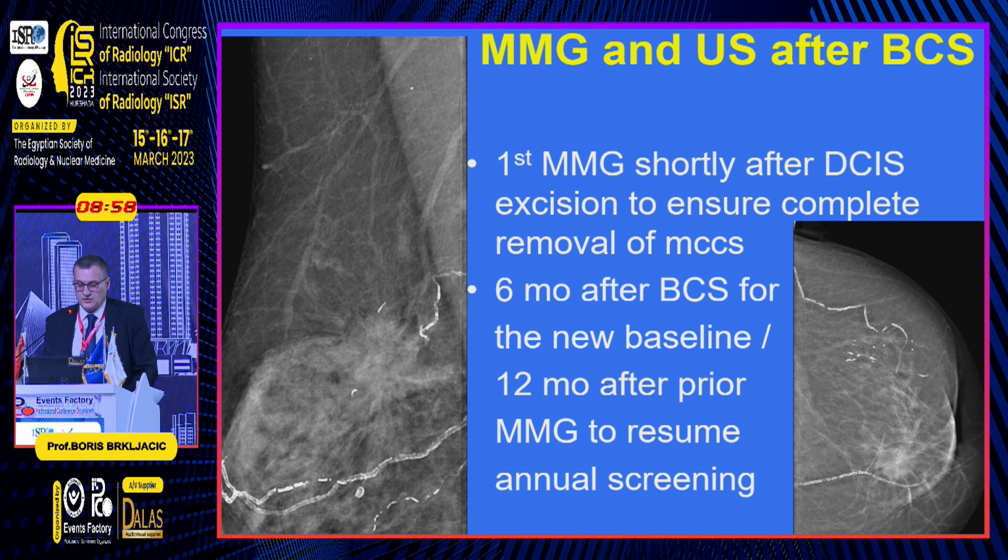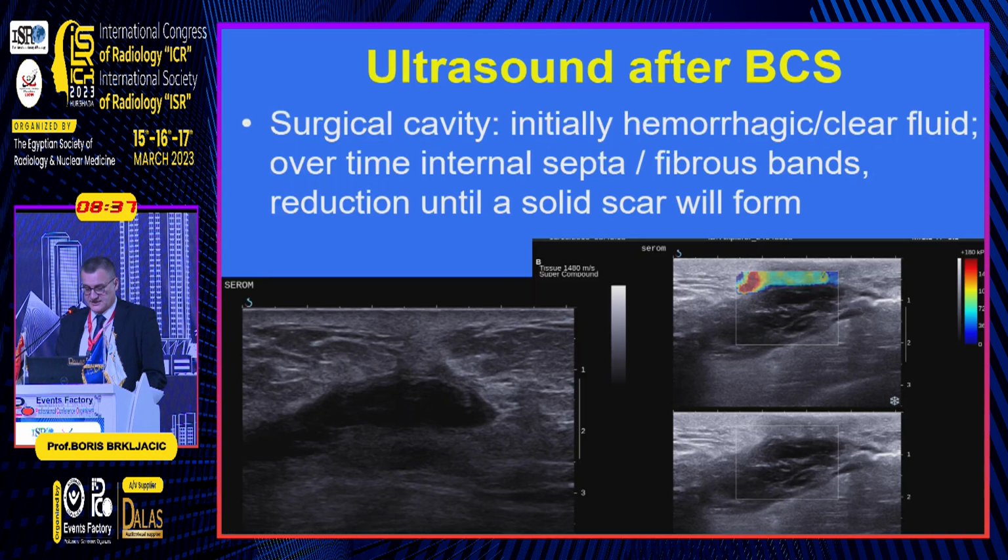Now we do mammography and ultrasound after breast conserving surgery, first mammography shortly after, for instance, excision of ductal cancer in situ to ensure complete removal of microcalcifications. Then 6 months after for the new baseline, and then we continue to resume annual screening after a year.